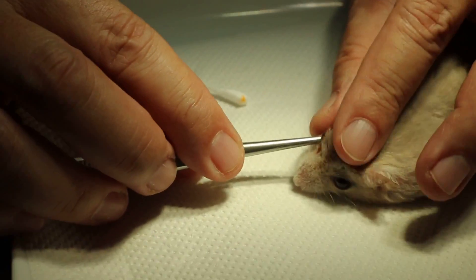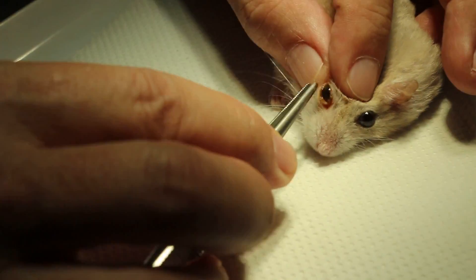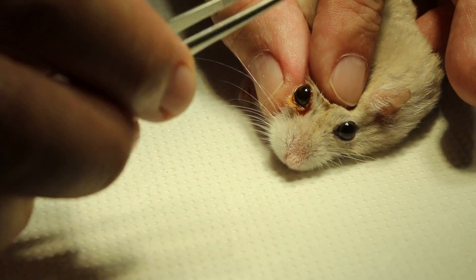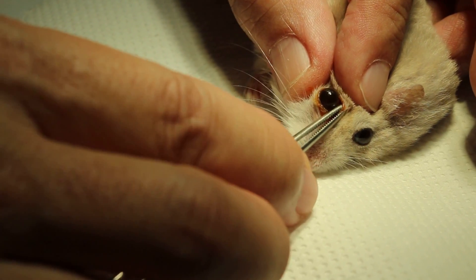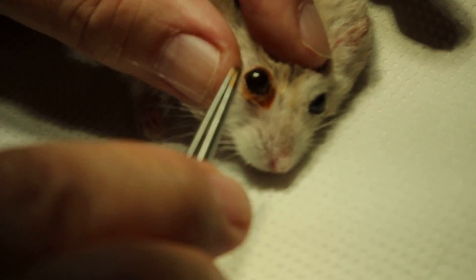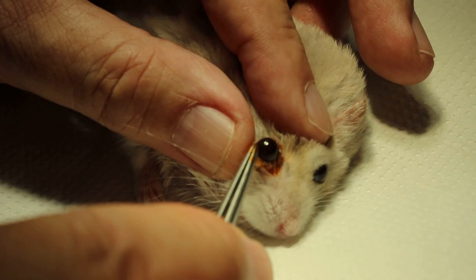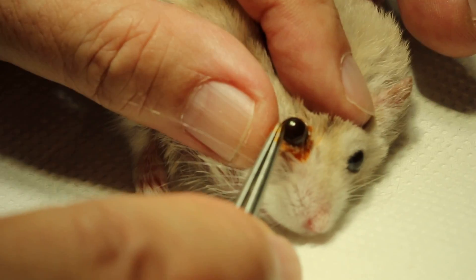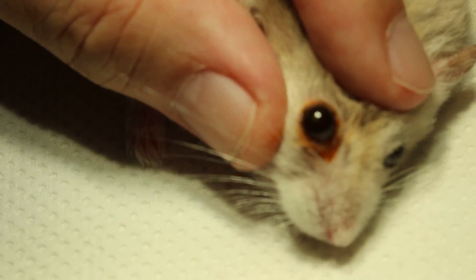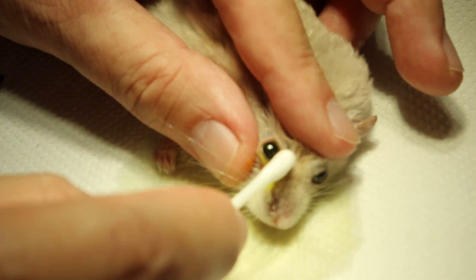Check whether the third eyelid and lower eyelid have any abscess or not. There is a green ulcer, so it's quite a recent one. You can see it's green — it's only about 2mm. It's definitely a green ulcer, so it's a recent ulcer. We flush out the area — you can see it's very curly. There is a reason why the hamster is still scratching.